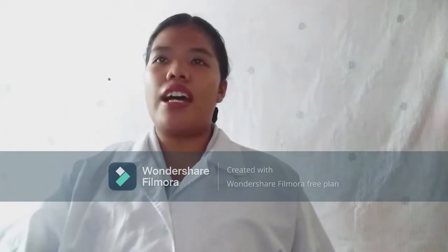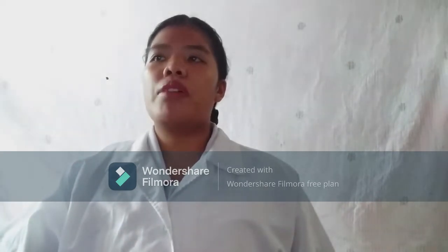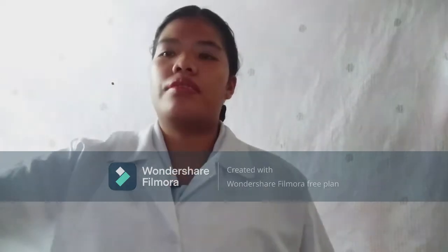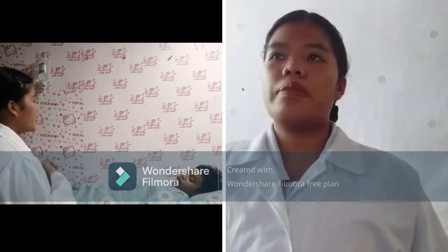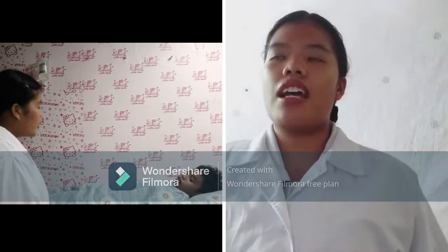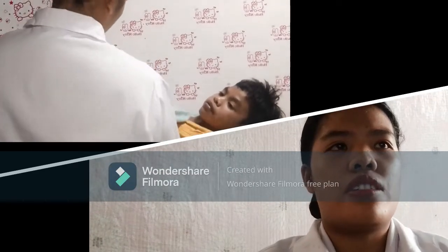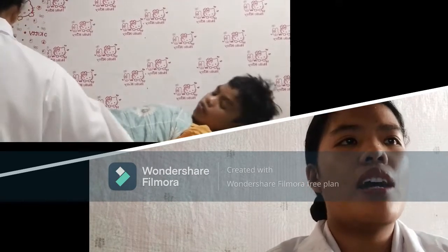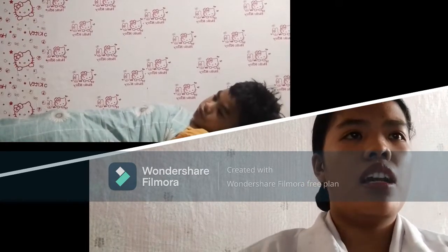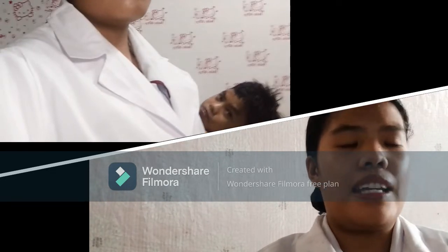Notify the physician or nurse who will insert the IV. When he or she arrives, bring the preparation to the bedside. This facilitates accomplishment of the task. Then, identify the client and explain the procedure. Explanation allays the client's anxiety. Place the client in a supine or low Fowler's position. The supine position permits either arm to be used and allows for good body alignment. The low Fowler's position is usually the most comfortable for the client.